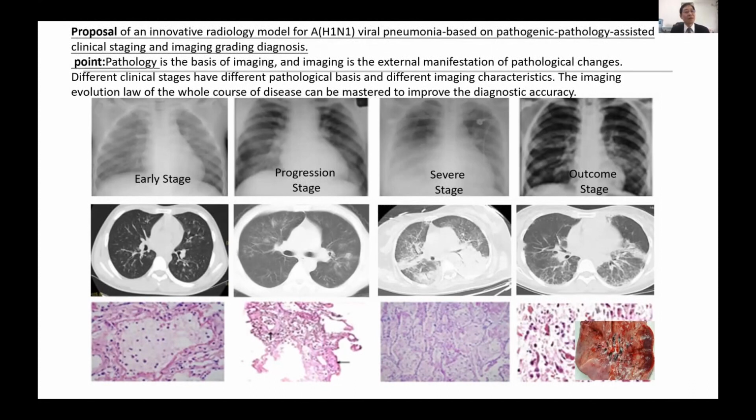Recommendation of an innovative radiology model for H1N1 virus pneumonia based on pathogenic and pathology, combining clinical stage and image grading diagnosis.